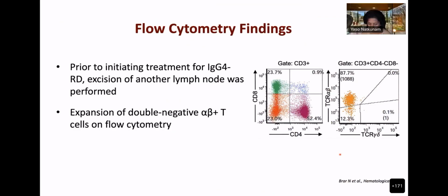Dr. Soumyaranjan asks, what is the ratio of IgG and IgG4 in the lymph node? So you follow the same criteria as defined in the pancreas and other places. It can be focal. Usually it's defined by high power field, having more than 100 IgG4 cells, or more than 40% if you're looking at it as a ratio of IgG4 to IgG.